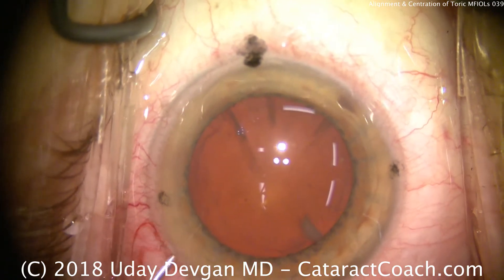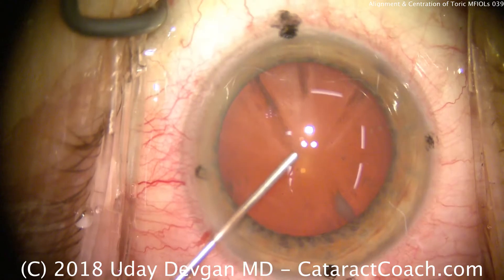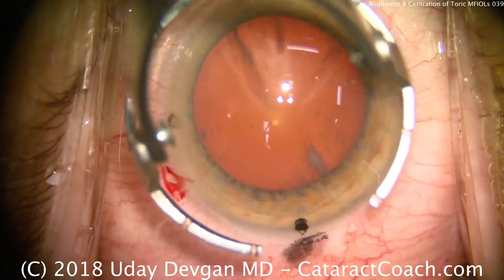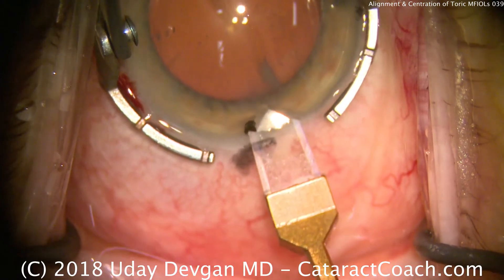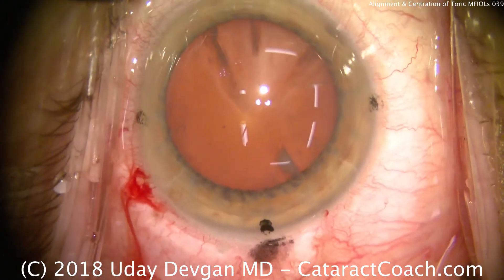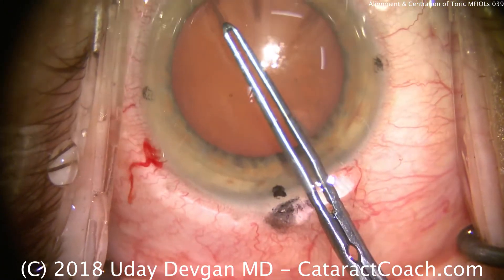Now using a dispersive viscoelastic, we'll fill the anterior chamber and coat and protect the corneal endothelium. The steep axis was 100 degrees, so we'll make the main incision about 90 degrees away. That will slightly increase the astigmatism, which is okay — we can adjust the toric lens power. But it won't change the axis, and that's important.